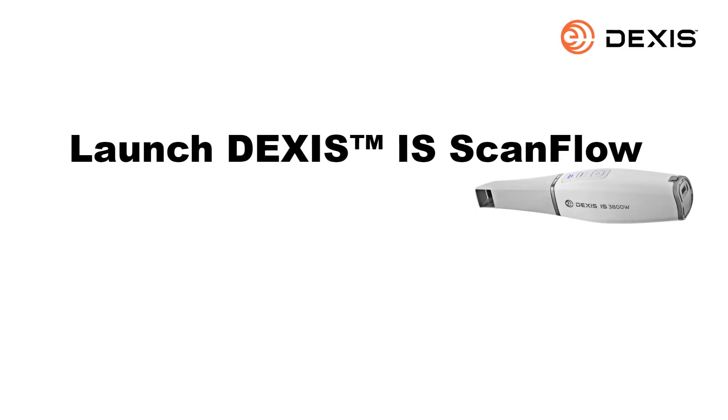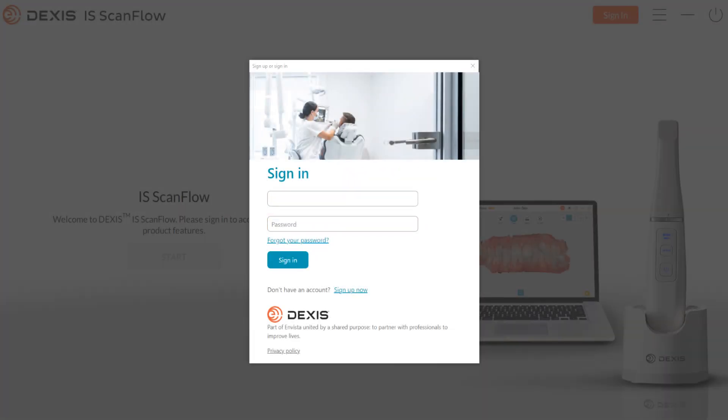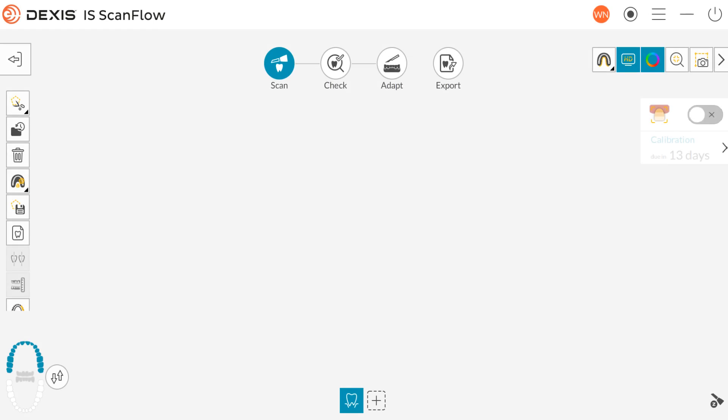Launch DEXIS IS ScanFlow. Sign in with your registered email address and password. If you do not have an account, click Sign Up and create an account. Click Sign In. The Welcome window is displayed. Search or create a patient and choose your patient. The Patient Information window is displayed. In the Patient Information window you can choose to scan, import a scan, or choose the intraoral camera to launch it — note, this option is available for IS3800W Premium users only. Click Scan; the DEXUS IS ScanFlow window is displayed.